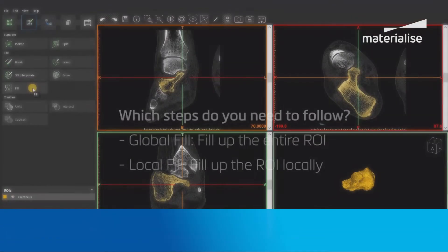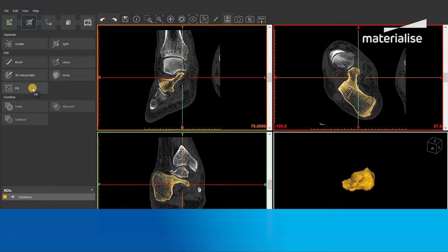To be able to use the fill tool you will first need to have a region of interest. This region of interest can be any anatomy region you want to fill up. The tool consists of two main parts: the global fill and the local fill.